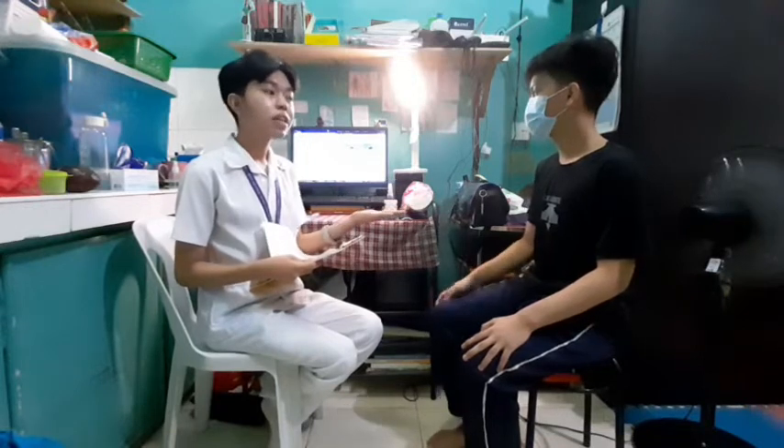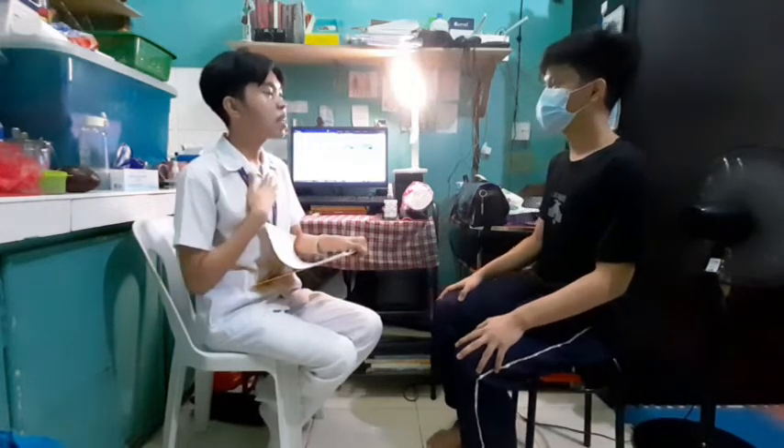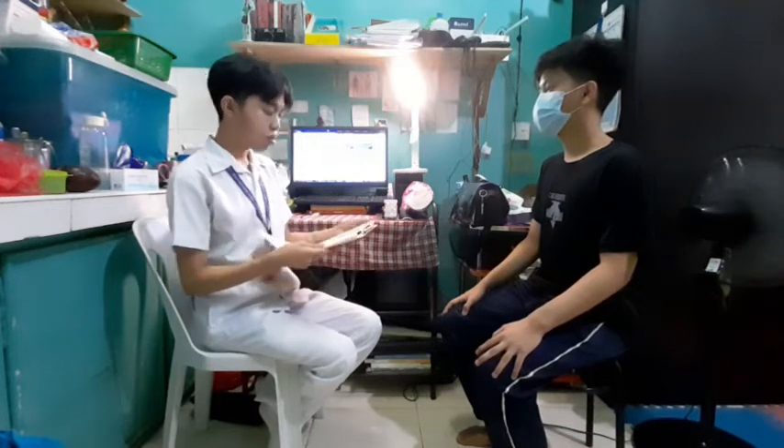Prior to performing any procedure, I must first introduce myself to the client and let them know what procedures will be conducted. Hello, my name is Sunny Galaura, your student nurse for today. Today we will be taking your body temperature using your underarms. Is it okay for me to take your temperature? Yes. May I ask if you have any lesions, wounds, or any problems with your arms? Asking that helps us determine if the axillary method is suitable. Since no problems were reported, that's good to hear.